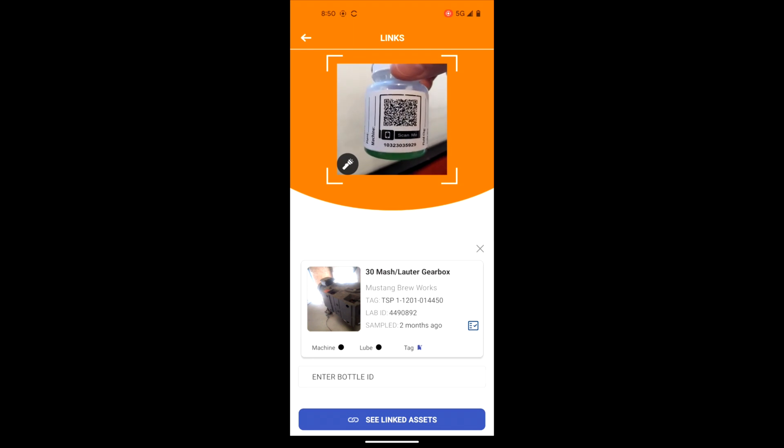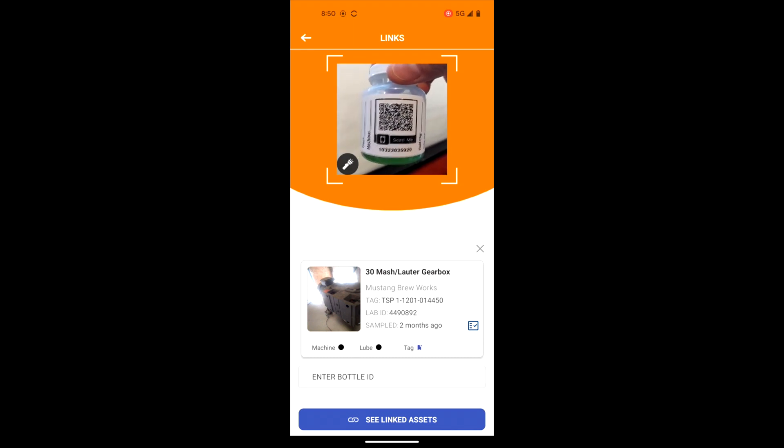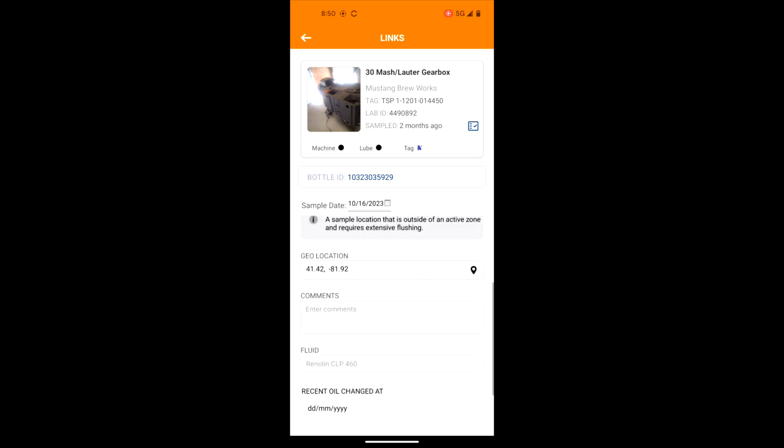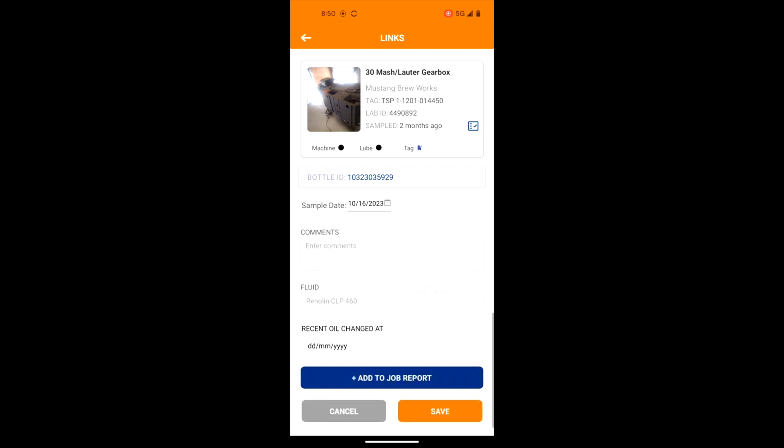Next, scan the QR-coded sample bottle. Enter sample specific information such as fluid and machine hours, indicate a fluid change in date, enter freehand typed notes, then when ready select save.